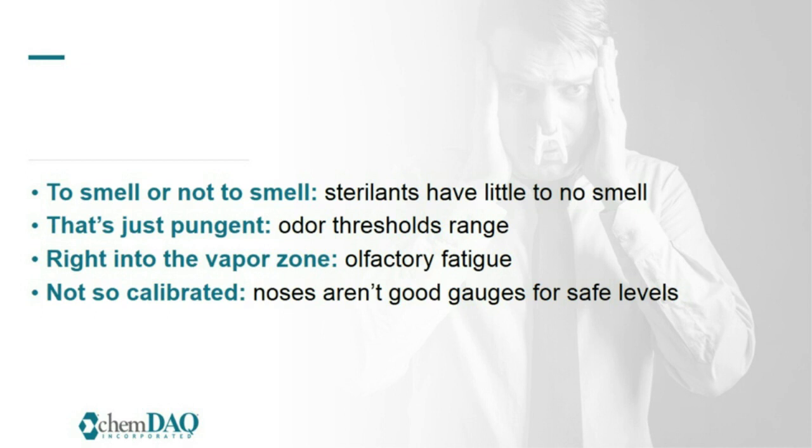Next, I want to talk about an old Top Gun song, if y'all remember this, Right Into the Danger Zone, where we're going to talk about right into the vapor zone. Many gases and vapors are subject to olfactory fatigue, meaning our nose gets tired. Prolonged exposure to gas vapors reduces the sense of smell over time.